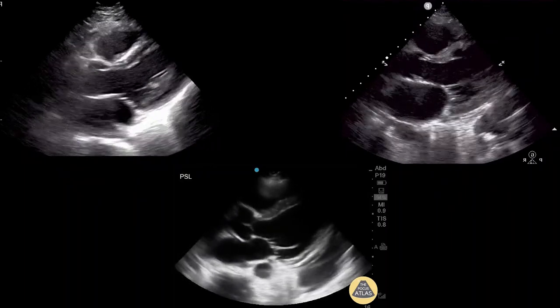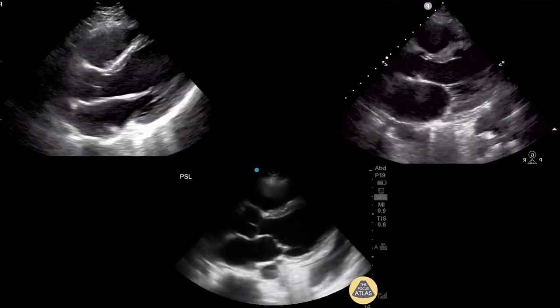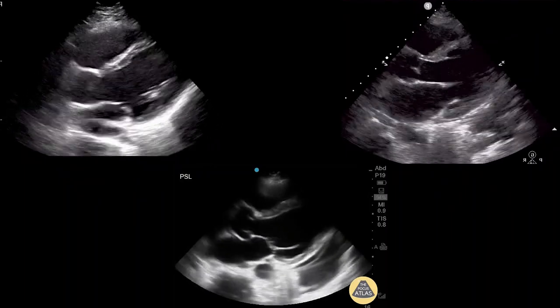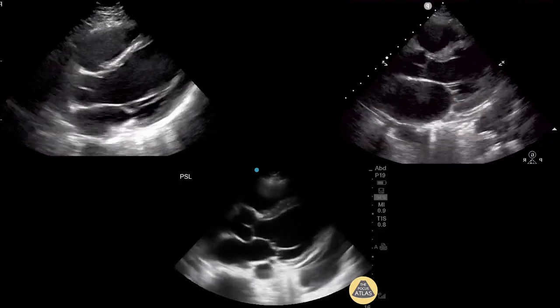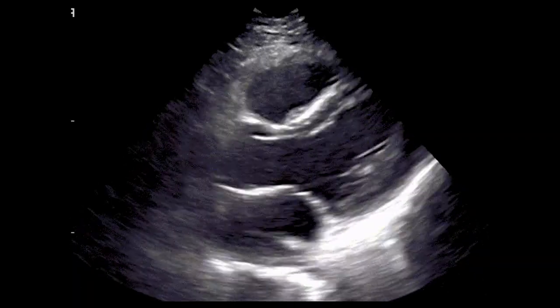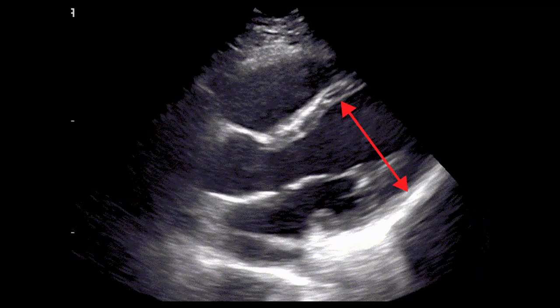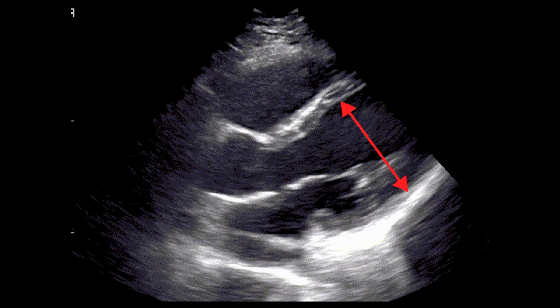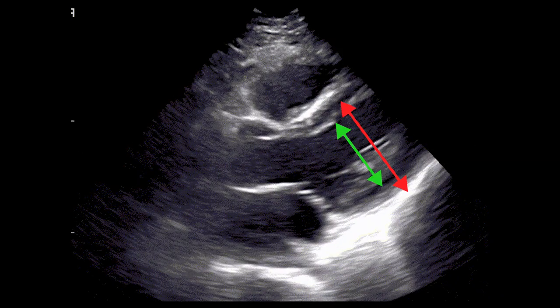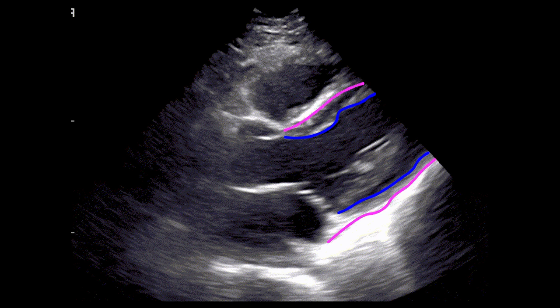These three clips show representative images of each bucket in the parasternal long axis view. In this view, you should look for fractional shortening, or the relative change in the anterior-posterior dimension of the LV chamber, though be careful to judge this using the endocardial borders rather than the myocardium or pericardial border, as these structures are much more eye-catching but can be misleading.